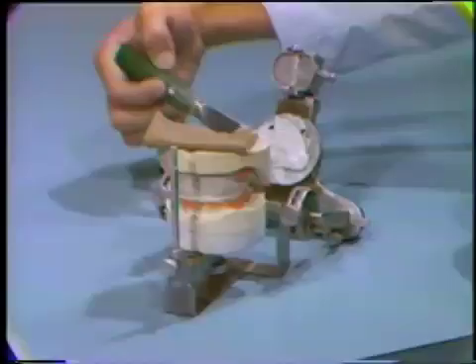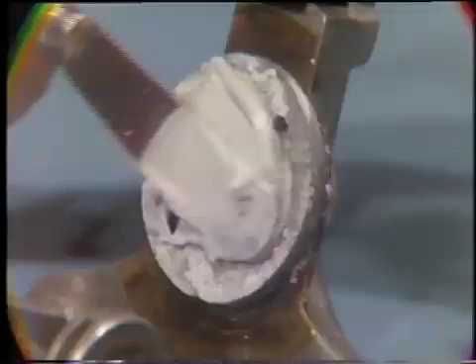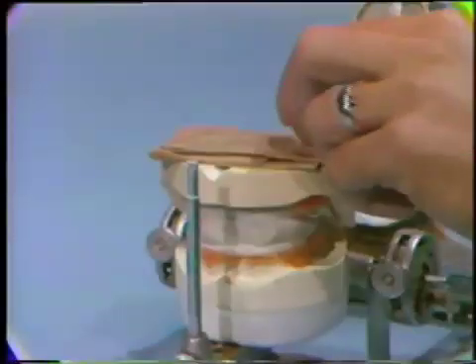Fasten the cast to the mounting ring with impression plaster. Be sure to place an adequate amount of plaster into the retentive areas of the mounting ring so that the master cast will not separate from the ring.